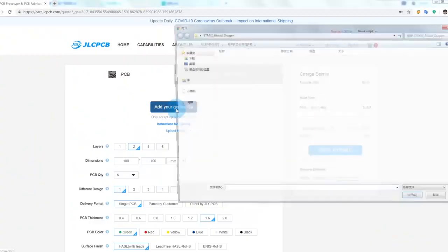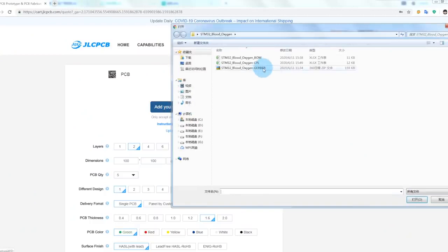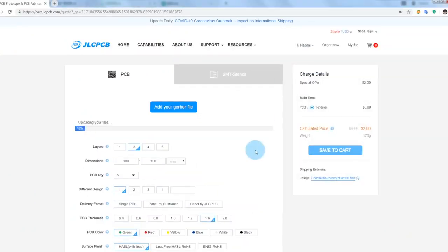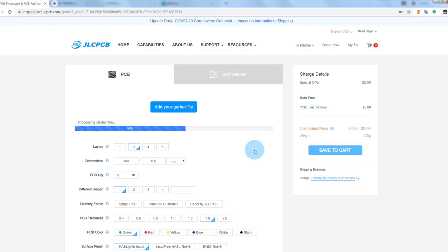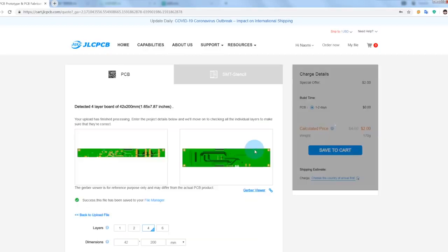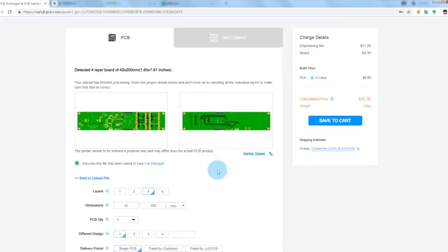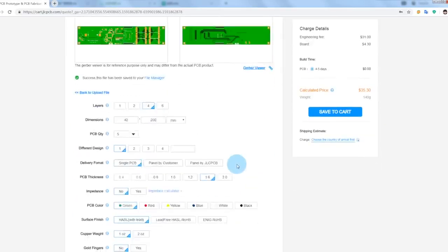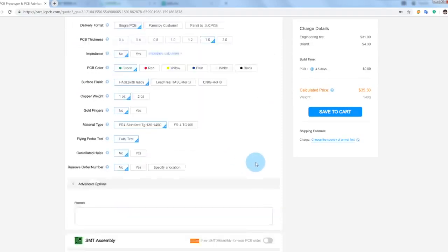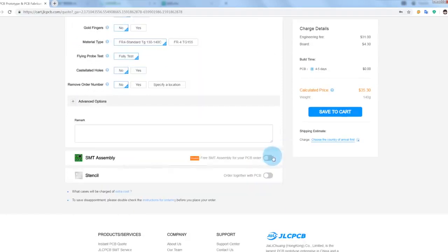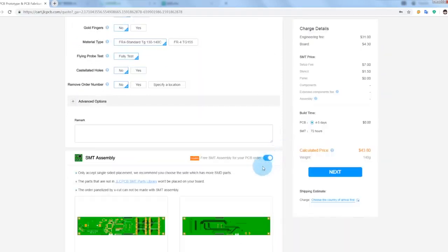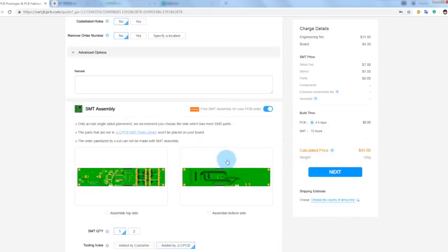Okay, first let's add our Gerber file on the JLCPCB interface. And it takes a few minutes to process the Gerber files and make sure it's alright, so please be patient. Okay, it detected a four layer board, let's scroll down and let's select SMT assembly.